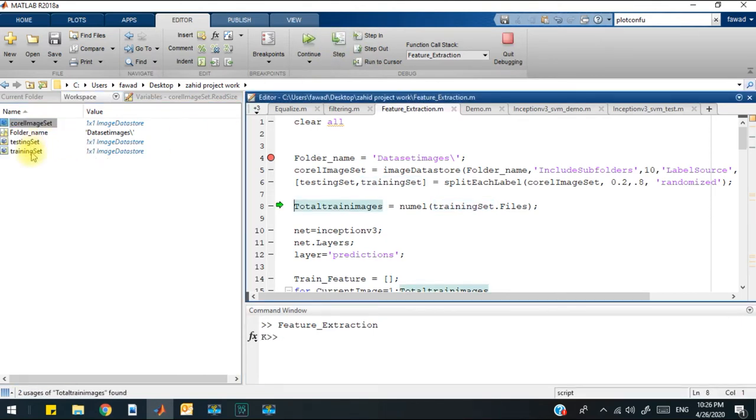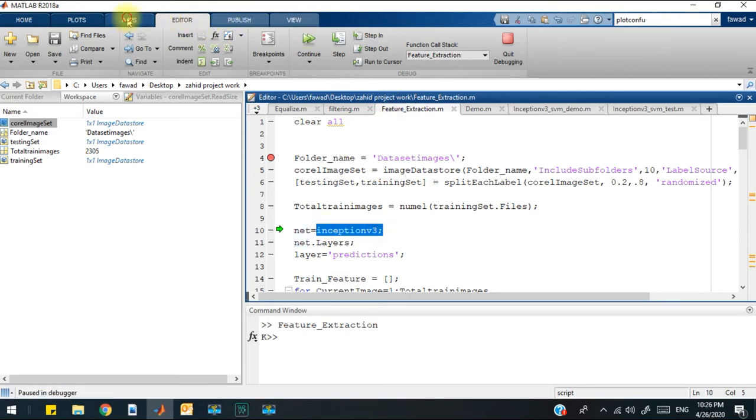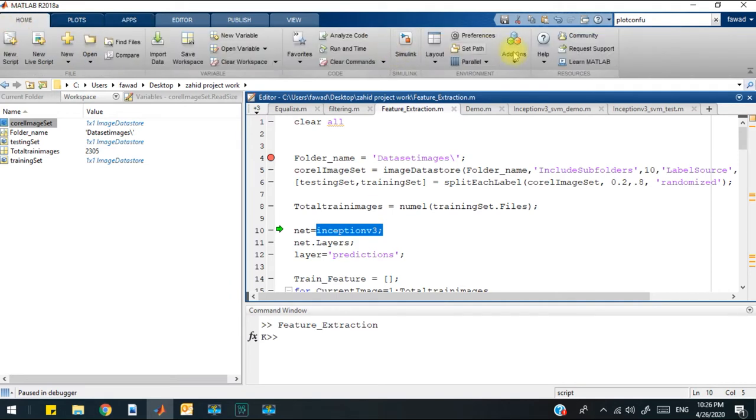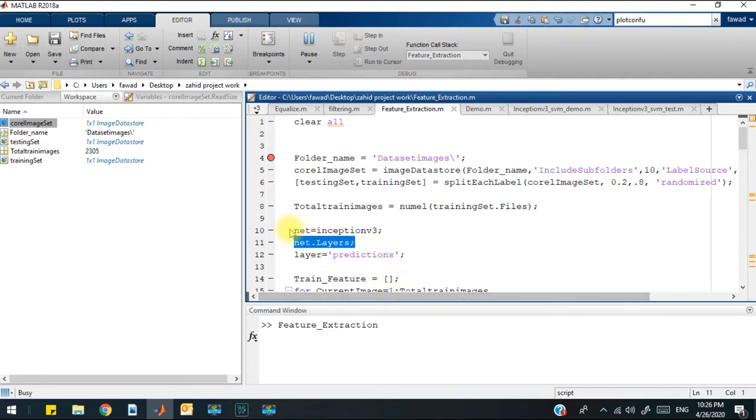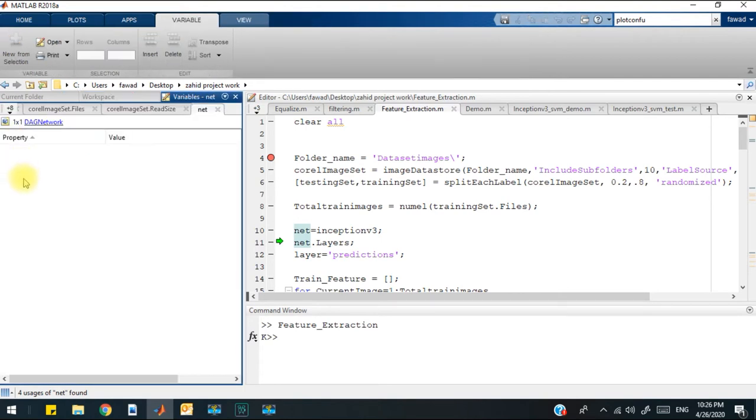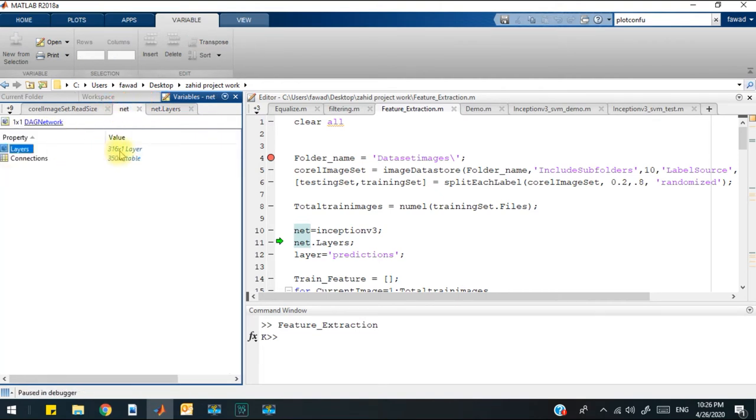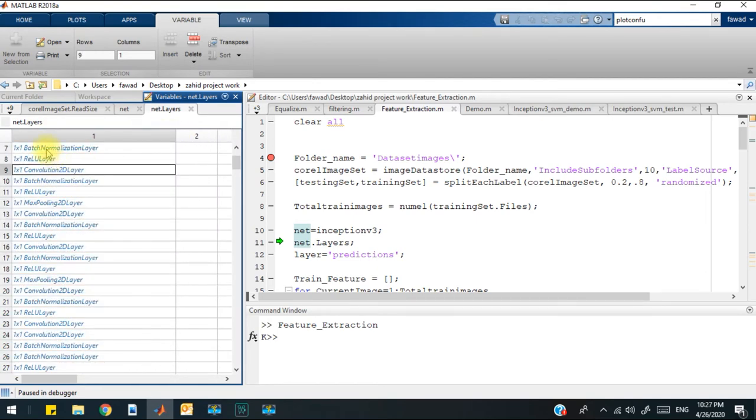After that, I will define the neural network Inception V3, which I have downloaded from the add-on. I have downloaded this Inception V3 model from the add-on, and if I execute this line, you will see the complete detail of the neural network model. These are all the set of layers. The total number of layers are 316, and you will see the name of all the layers.